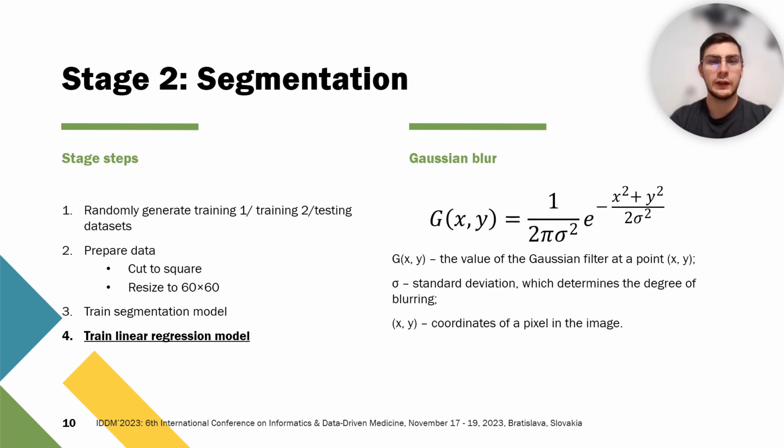Since the model is trained using resized images, it is necessary to return the image to its original size before testing it. However, usual resizing causes lots of lost details and may cause some artifacts. It of course has effects to the final result. To solve the described problem, we propose to use blurring technique to smooth transition between pixels and create more natural and smooth effects when resizing images.